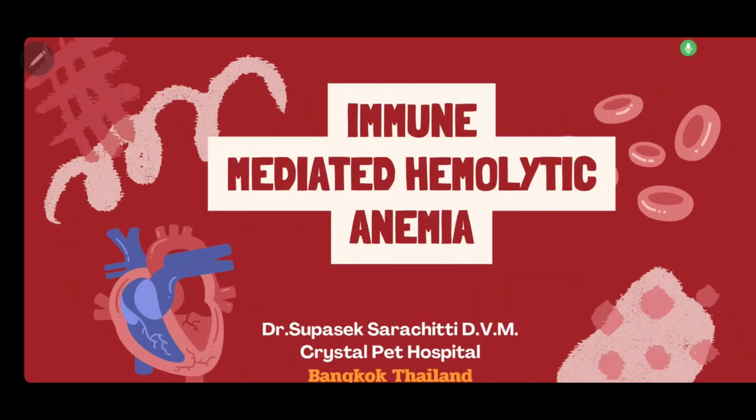Hello, today we are going to teach about IMHA. We will discuss how to read graphs related to immune-mediated hemolytic anemia, or what we call in Thai, the condition where the immune system destroys red blood cells.